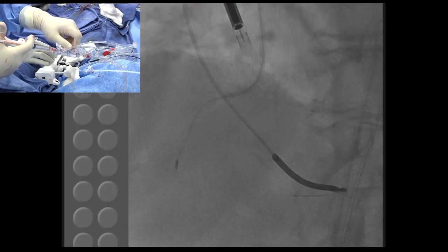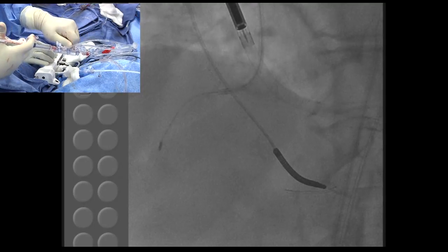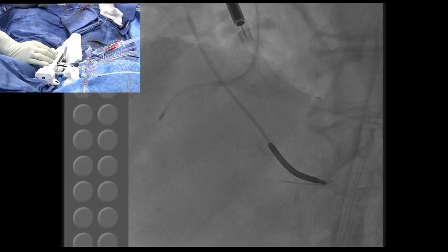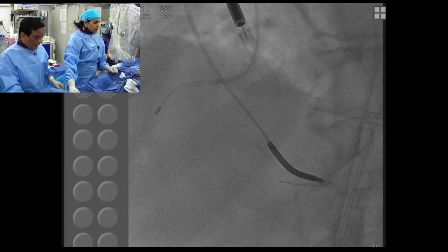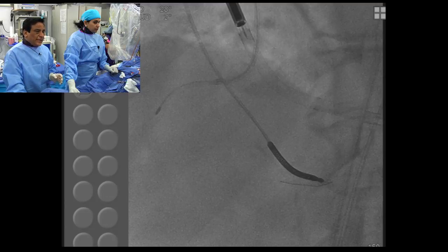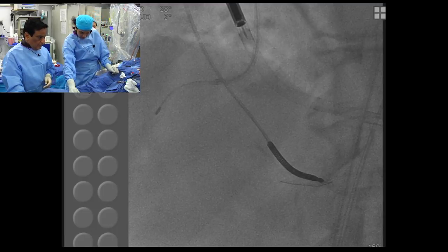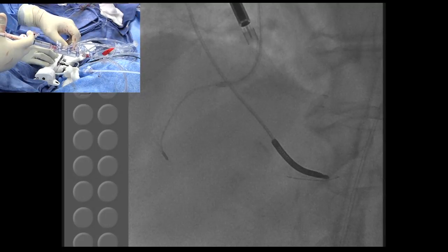I don't like the noise. 49, 48. Oh, this is that calcific. 46, 51, 20 seconds. The key is that it's a very risky rotational atherectomy, but there is no other way in this case to open this lesion, so we'll try as much as possible. Also, I always say, once you see that you have ablated a little part of the calcium, you don't have to go all the way. That will be good enough to subsequently crack with the high pressure balloon, or maybe the lowest size AngioSculpt. No, I don't think AngioSculpt will go here. Okay, we are able to get through now. Advance a little more there.